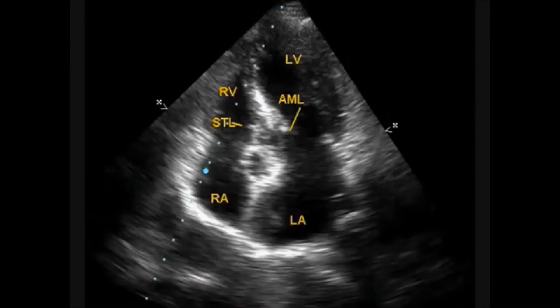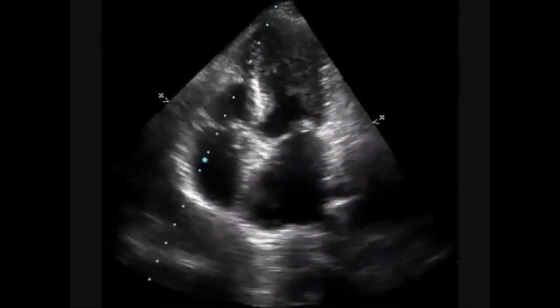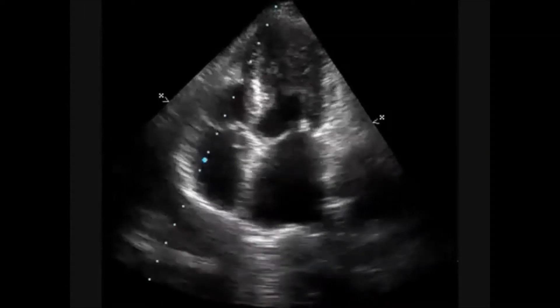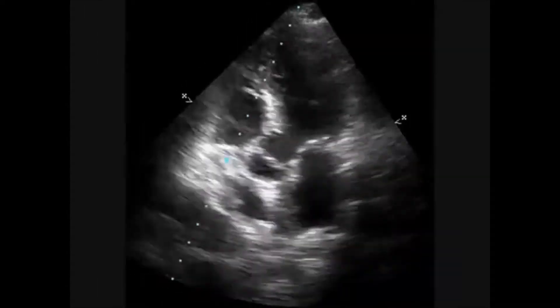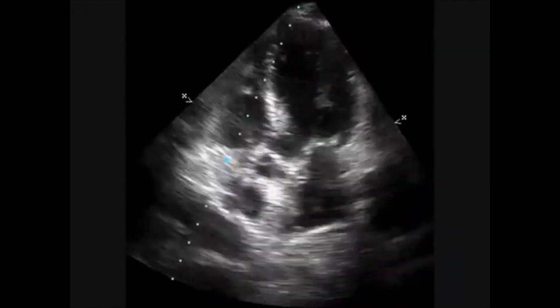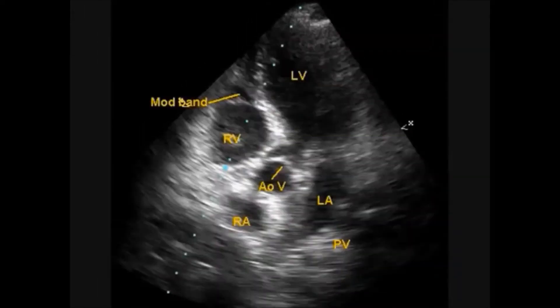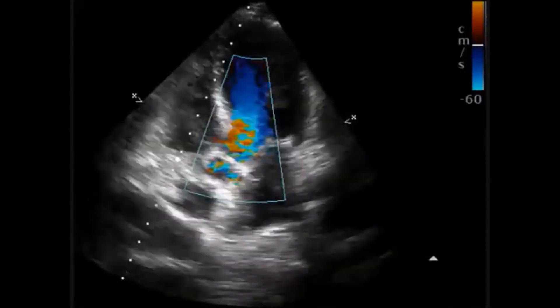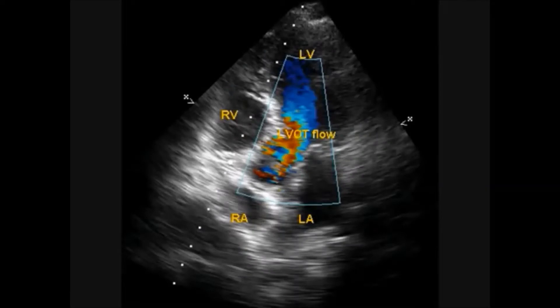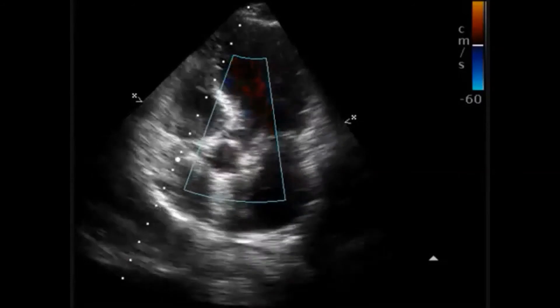This is another view of the same. In the apical 5-chamber view, the aortic valve is also seen as well as the moderator band. Colour flow in the aorta is visible in this view.